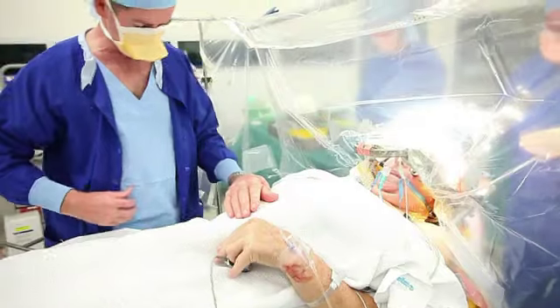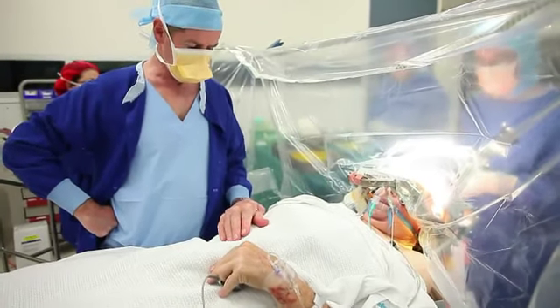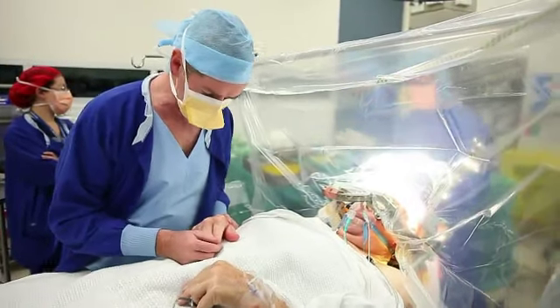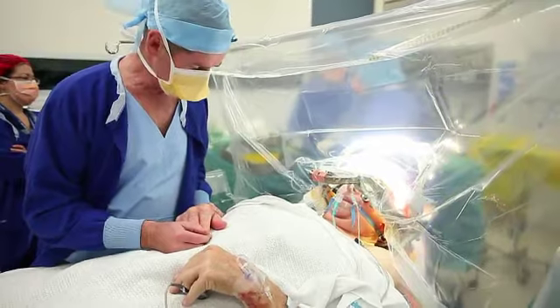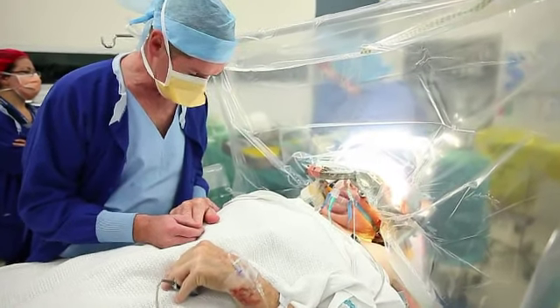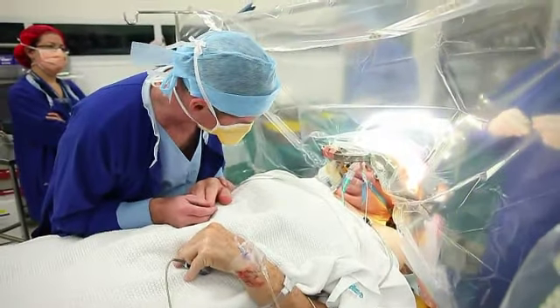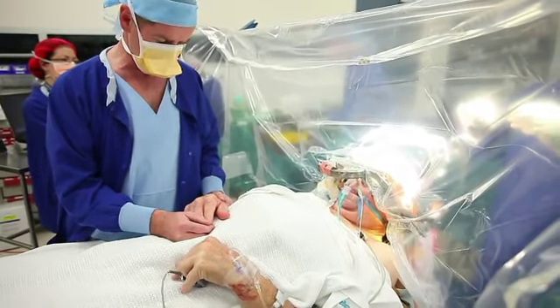Sometimes we do that on the same day of surgery; other times we bring them back a week or two later and do it as a separate procedure. During the surgery patients are awake in most cases. Very occasionally, if patients aren't able to stay still or their movement disorder is so severe, we might give them some sedation, and occasionally we might give them a general anaesthetic. Having the patients awake and cooperative is really important in terms of allowing us to get the electrode in the right spot.